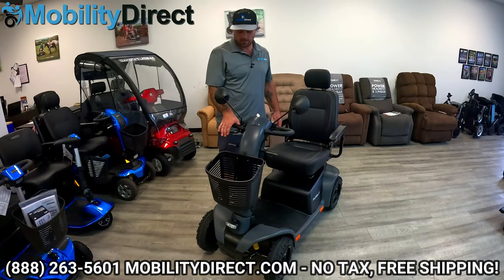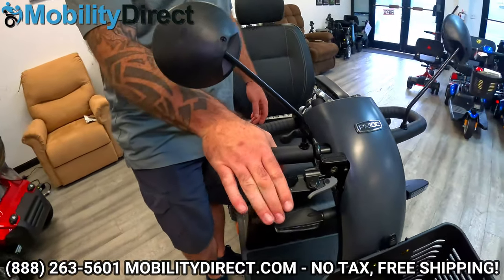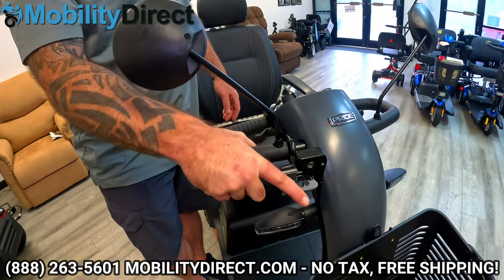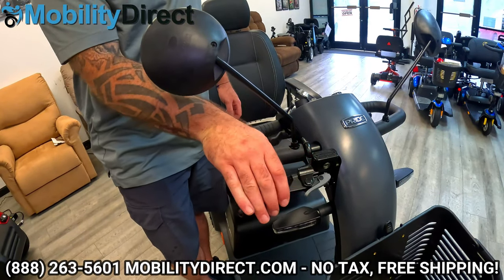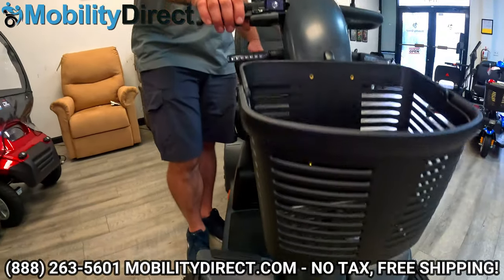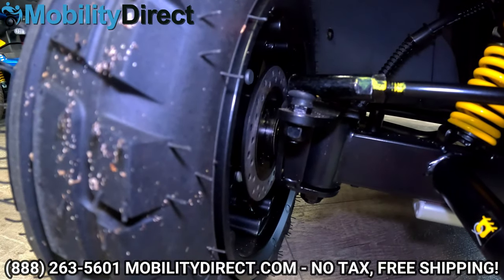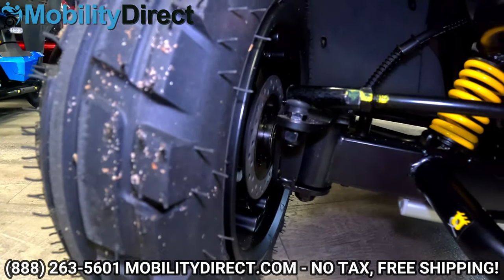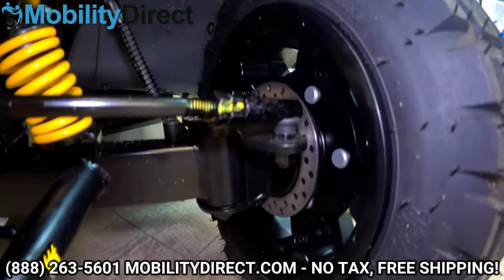Last but not least, we have our brake here, and you can lock the brake just like so. These are disc brakes on the front end, so this lever will activate the disc brake in case you need to stop in a hurry. The scooter does stop pretty quickly on its own, but if you need a little extra help, just squeeze this handbrake — and you can set it as a parking brake as well.